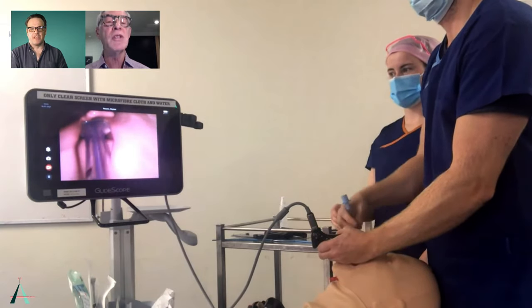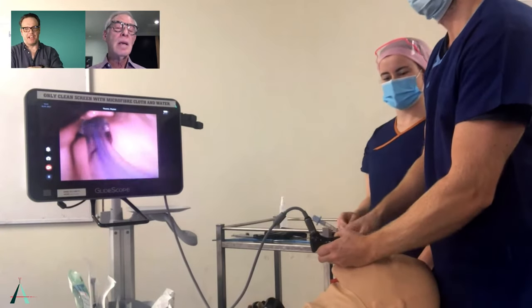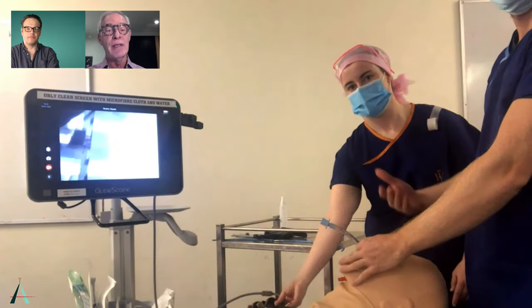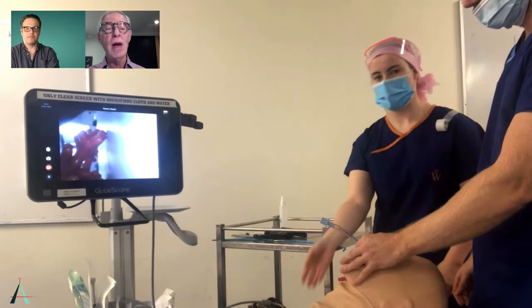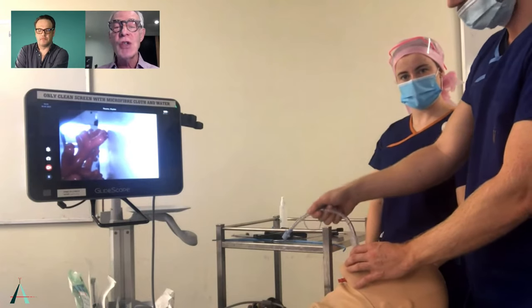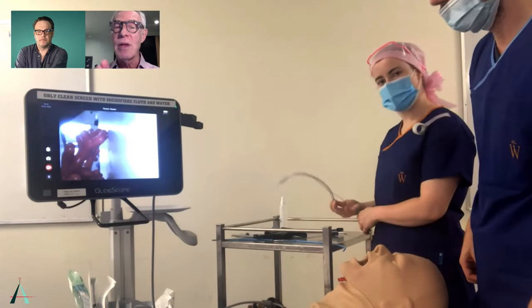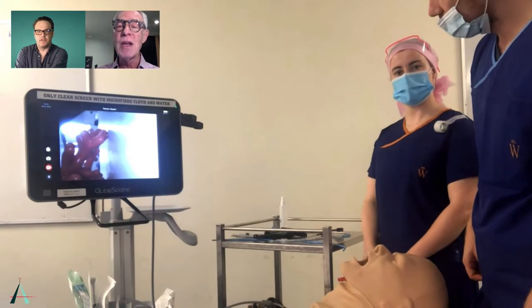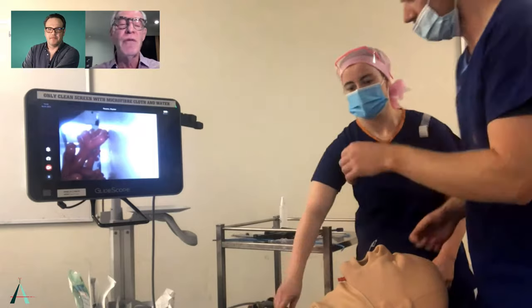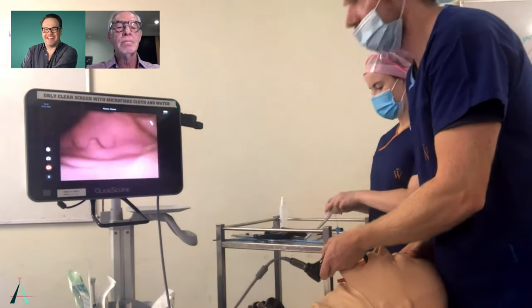Now I think we're just dealing with plastic on plastic. I think what you're seeing there is a bit of friction from the plastic. It's very hard to get the mannequin lube down that distally. But his approach is coming a little bit from the left. And I'm finessing the point here, but I would try to just change the angle slightly on the laryngoscope so that you're not intubating tangentially. I don't know if that makes sense to you, Matt. Do you want to have one more go, Matt? It's really a very minor recommendation. Because we really want you to leave on a high here, Matt.